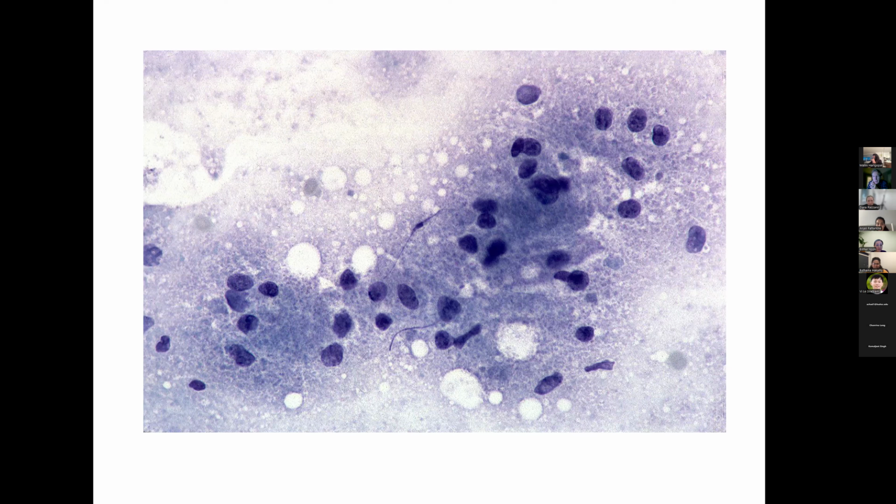I'm going to pick on somebody. So, Anjali, why don't you go first? I think it's malignant because of high NC ratio. Yeah, it does have variable size, but I showed you the malignant aspirate, those were pretty large and they were intact single cells in the background. Here it's all a very granular, grungy background. So do you want to rethink your diagnosis? Maybe.